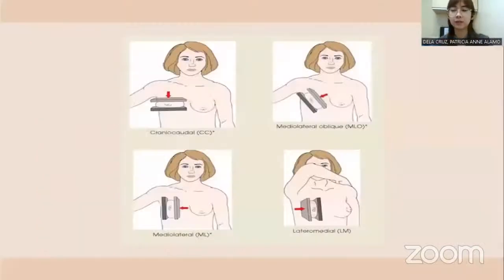So here are some of the views that are used in mammography: the craniocaudal, the mediolateral oblique, and the mediolateral. For standard protocols, we use craniocaudal and mediolateral oblique.